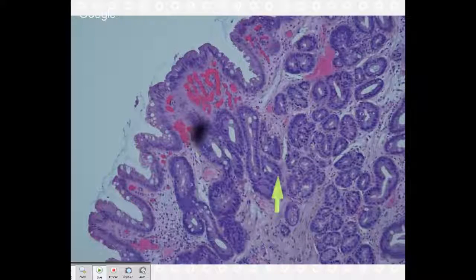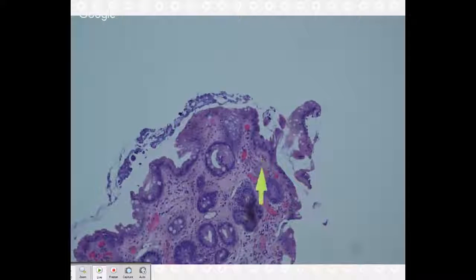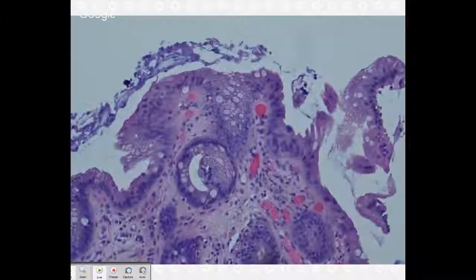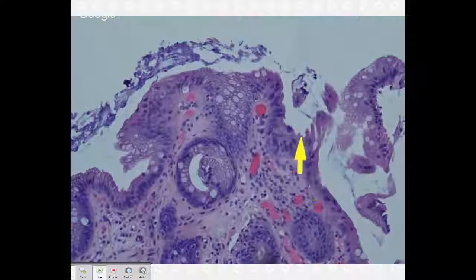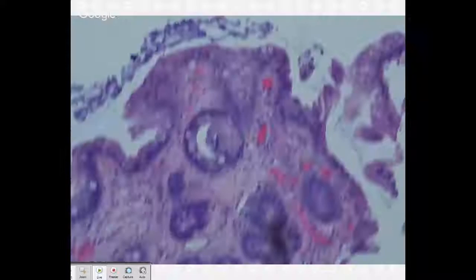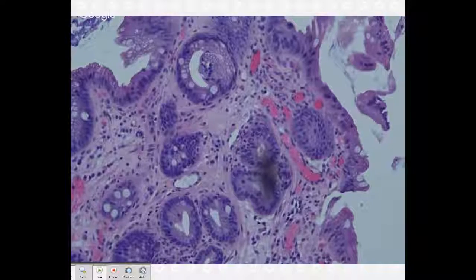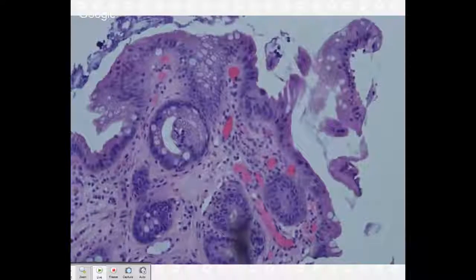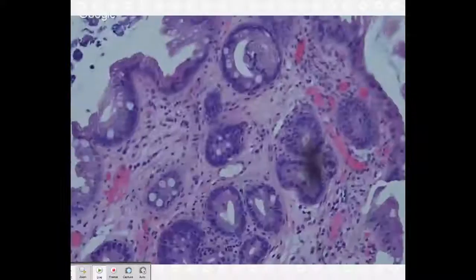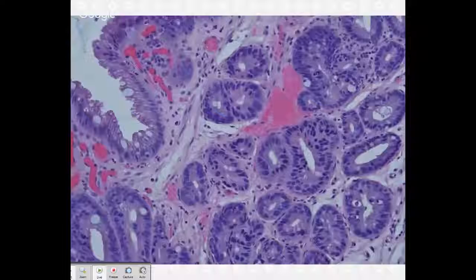The same thing here, really big cells. Let's see, this one was tricky because it only got up to the surface very focally because of the way it had been embedded. But again, mitotic figure right up there, piled up nuclei, another mitotic figure. And this one even has some inflammation. And so you may entertain the thought, could this all be reactive? And the answer is no. Much too much for reactive. It's just too much. As one of my attendings at WashU used to say, too much.